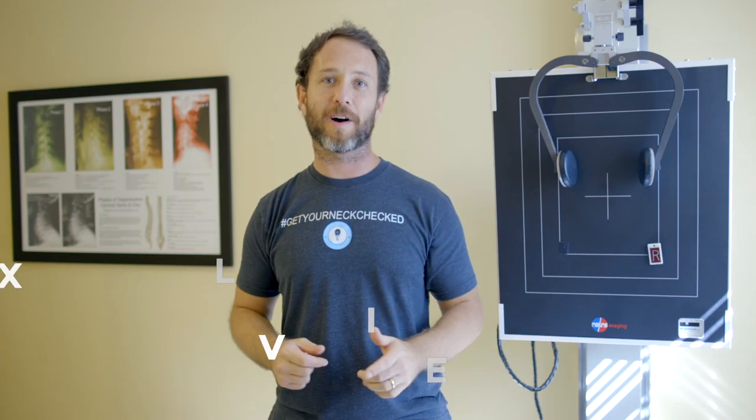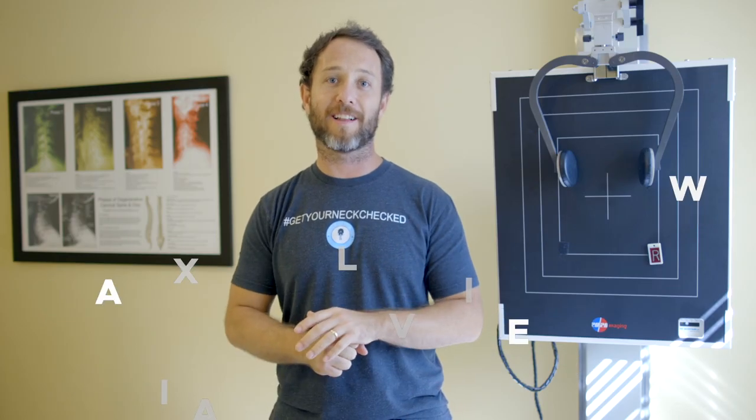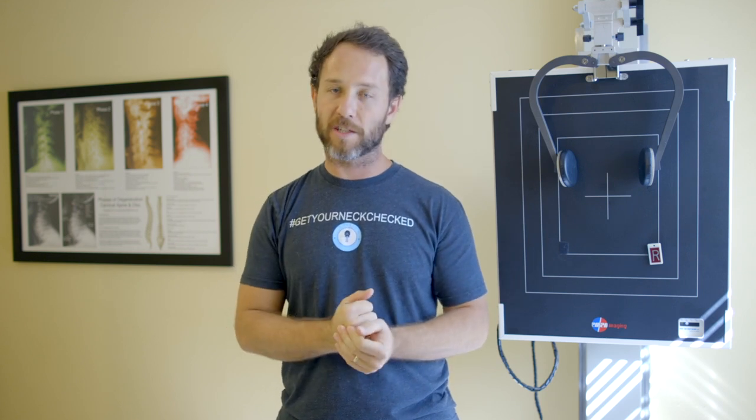Welcome back to Advanced Orthogonal with Dr. Collins. On this episode, we're going to talk about the axial view, also known as the AP open mouth. This is a standard view that should be taken in all cases.